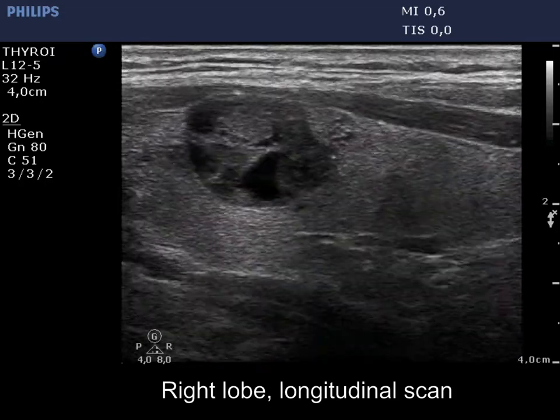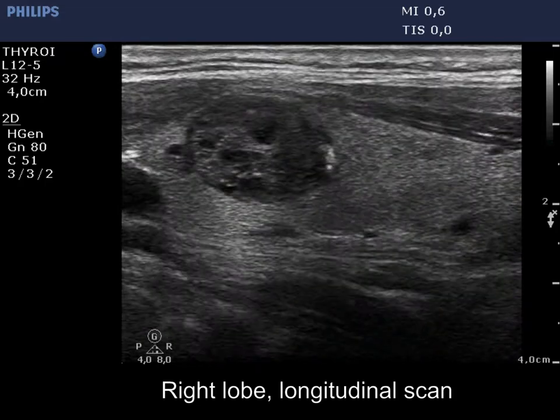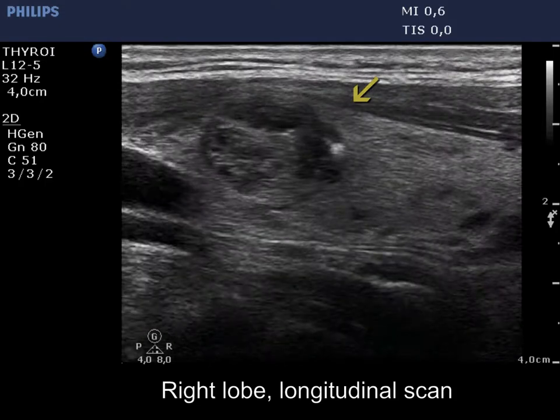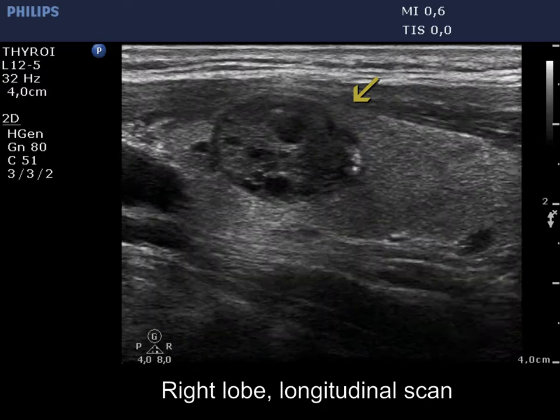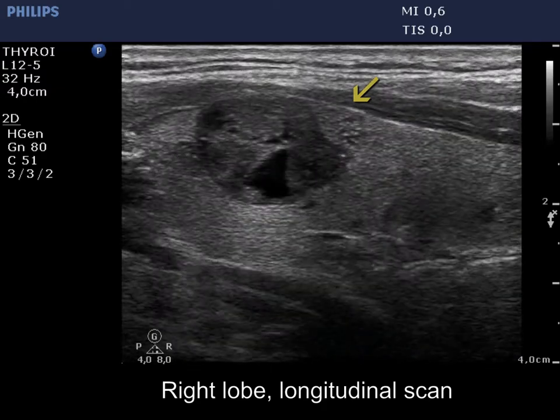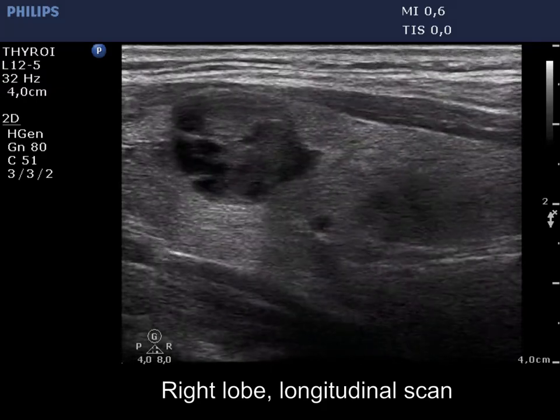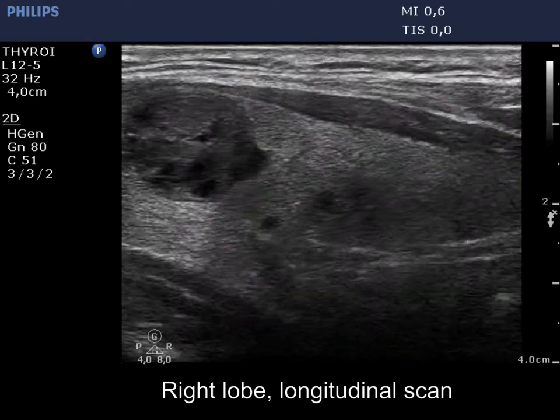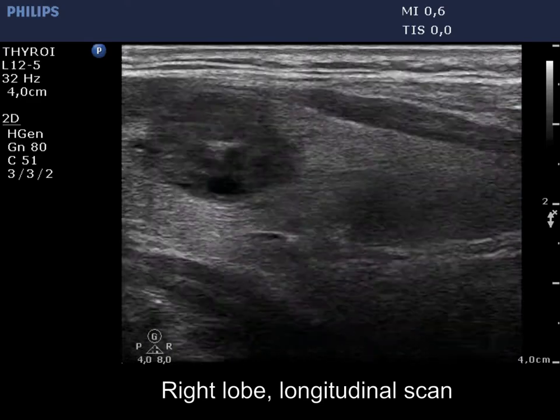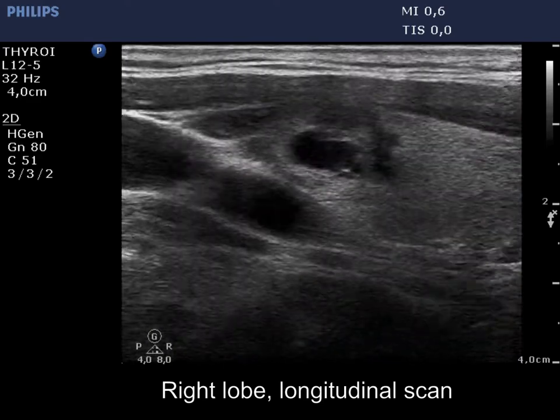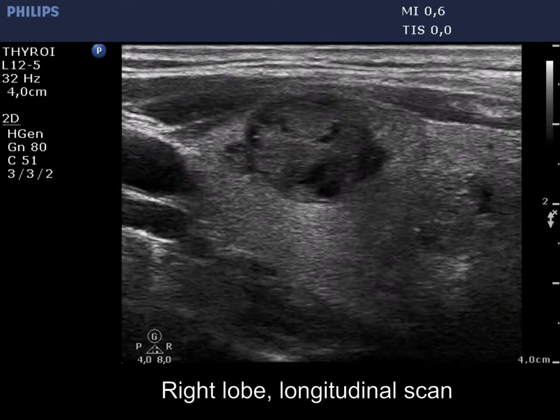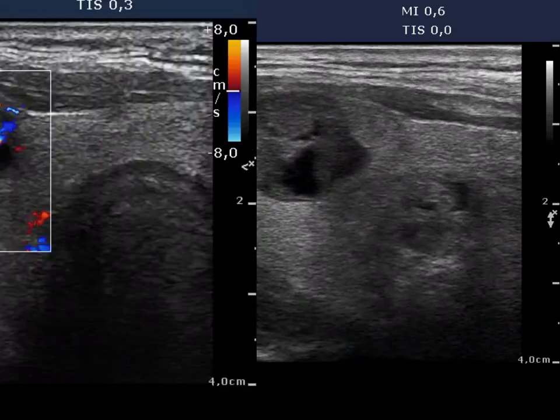We repeat the video in order to watch the nodule again. There is an impression in the lower part of the lesion caused by a smaller isoechoic nodule. This impression makes the surface of the nodule undulated; however, this should not be interpreted as pathological lobulation.